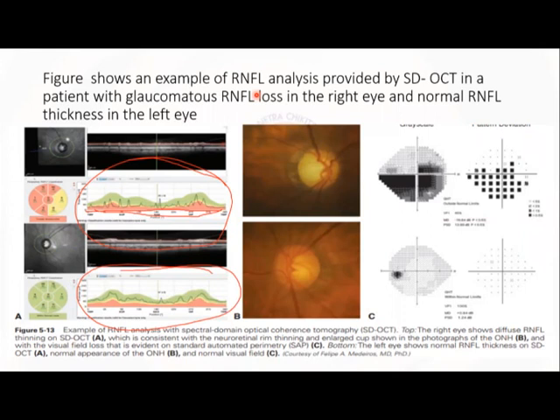Superior and inferior, whatever we have discussed, the superior pole and inferior pole are very much thicker. The RNFL also, superior and inferior, is thicker. So we have a double hump there: one hump is here and the other hump is here. So these humps should be followed. Sir, one doubt, in the central portion it is not following anything like here. Yes, that's what I am telling, it is fluttering like an ECG. It should not be like that. In this, they are telling that this left eye is normal, but this is also showing this kind of fluttering.